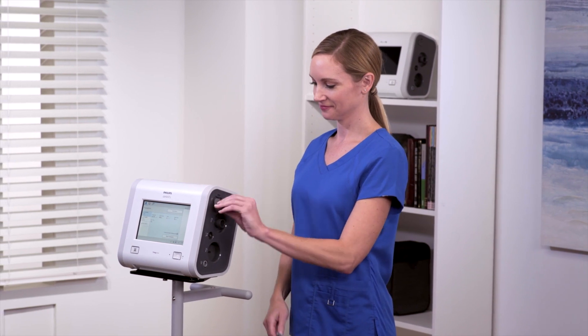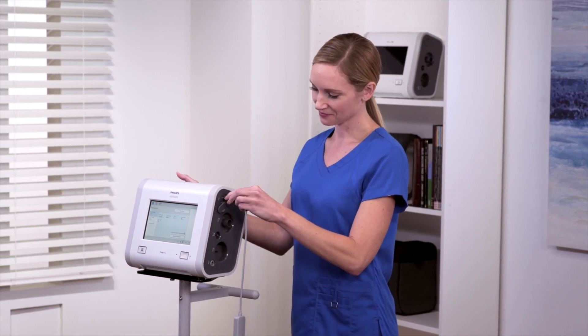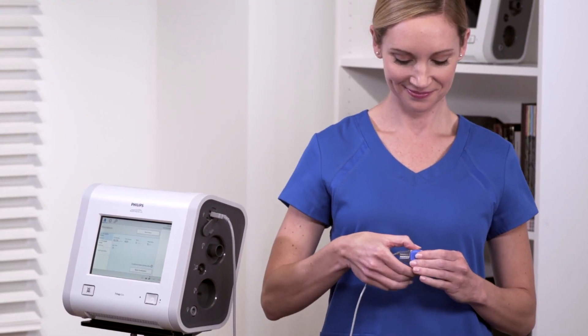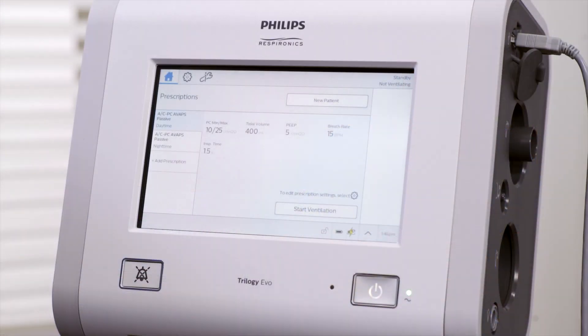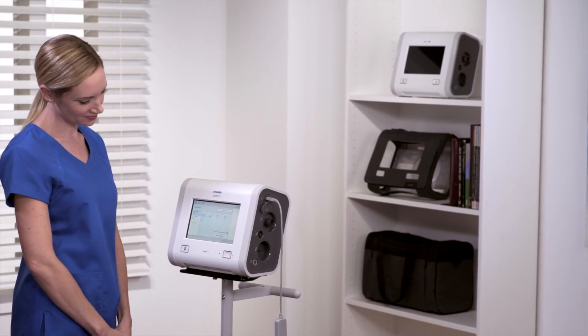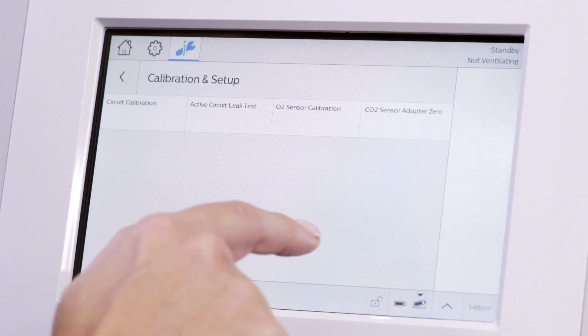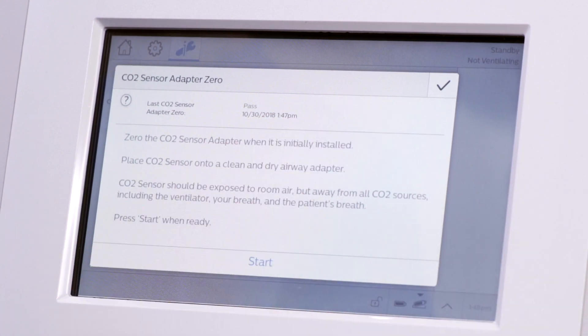To check EtCO2 levels, insert the USB end of the cable into Trilogy EVO and attach the appropriate airway adapter on the other end. The adapters are available in adult, pediatric, and infant sizes. The recommended procedure is to calibrate the airway adapter prior to use. To do this, go to the Options menu, tap Calibration Setup, then CO2 Sensor Adapter 0 and follow the on-screen prompts.